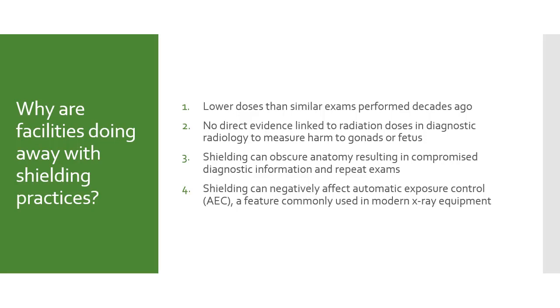Due to advances in technology and current evidence of radiation exposure risks, many organizations have reconsidered the effectiveness of gonad and fetal shielding practices. Evidence has shown that doses are lower than similar exams performed decades ago, and there is no direct evidence linking radiation doses in diagnostic radiology to harm to the gonads or the fetus.